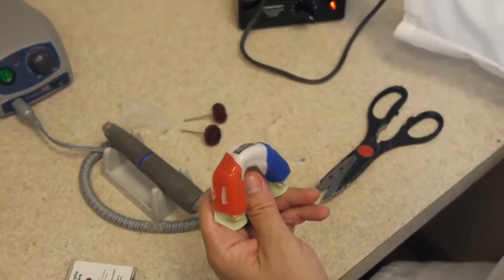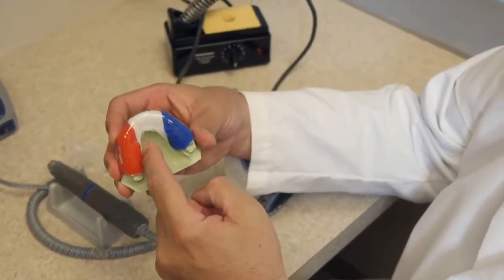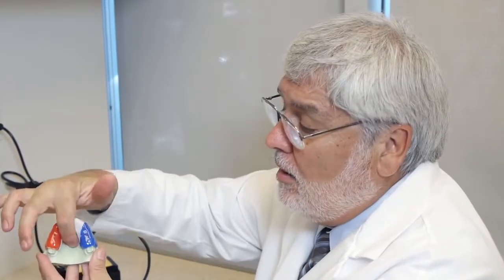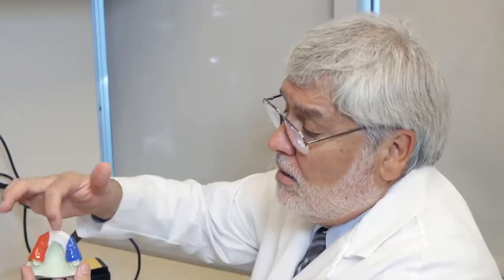Now, this last part is very key. We're going to trim this right to the teeth, and then I want a feather finish right here so the athlete doesn't feel a bulk material of mouthguard lingually. So they don't want to feel like there's something back there. They want to be able to talk as clear as I'm talking now. I don't want this thickness here. You don't need the thickness lingually. You need the thickness labially. So we're going to trim this portion now.